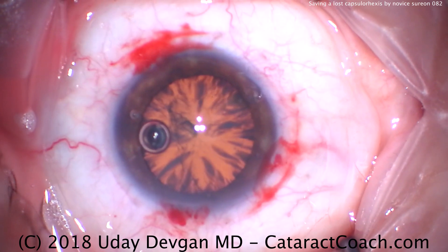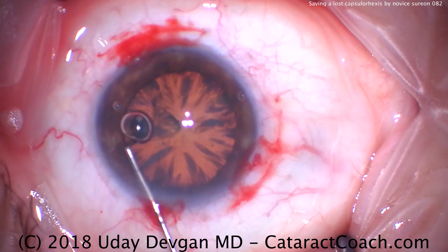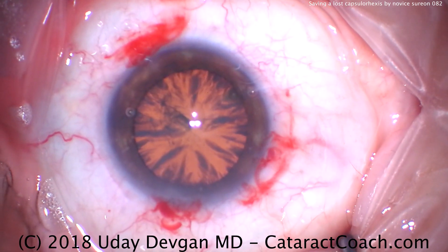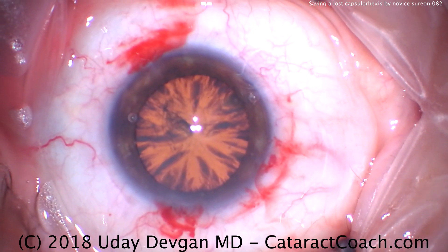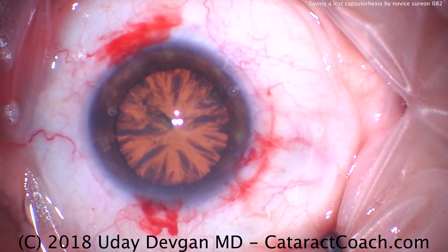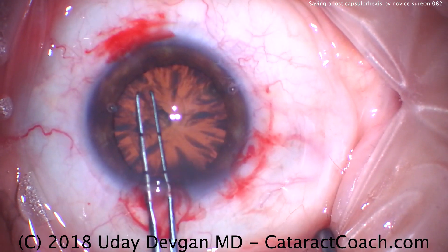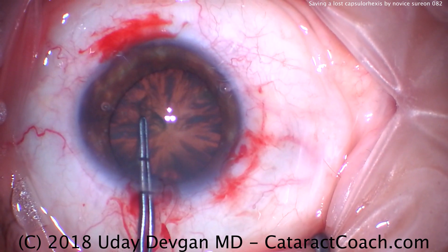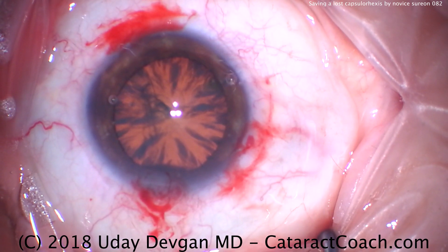So what should we do now? Let's put a little more viscoelastic and try to see what's going on — get that bubble out of the eye, make sure the cornea is nice and wet. Put a little more viscoelastic. We've got some sort of irregular small capsular opening, and if we can figure this out, great. Let's try to grab it where we think we left off, but it's not able to tear. Something is going on.